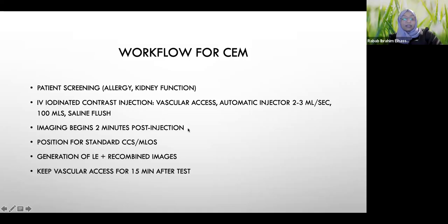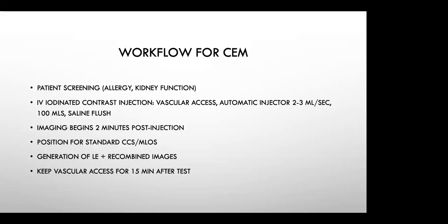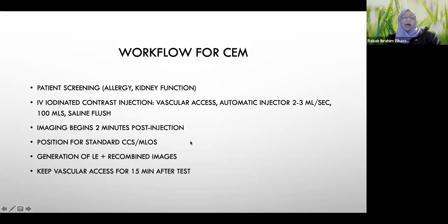So there is a timer on the machine. After you inject contrast and you flush with saline, you will start your timer. And the 2 minutes you will use to position the lady on the machine. So then we position for standard CCs and MLO views, as I said, and then the machine will generate the low energy and recombined images for you.